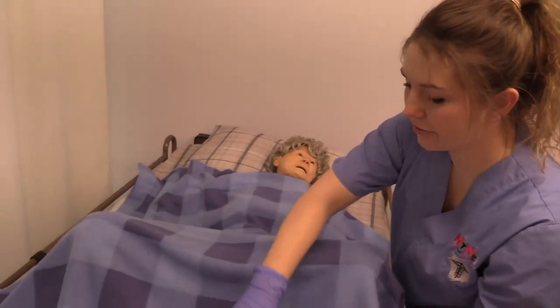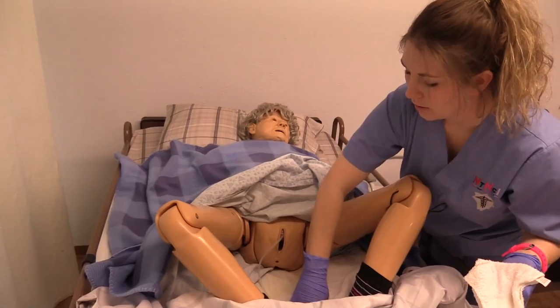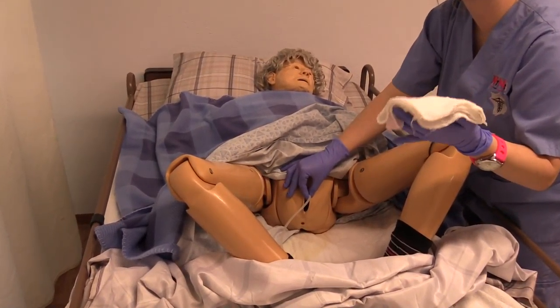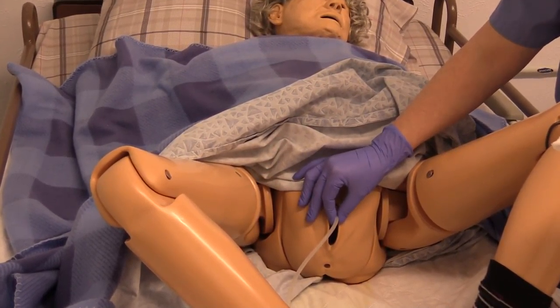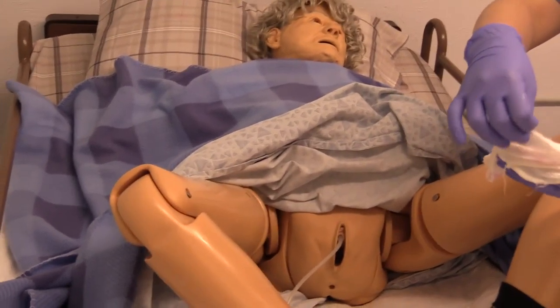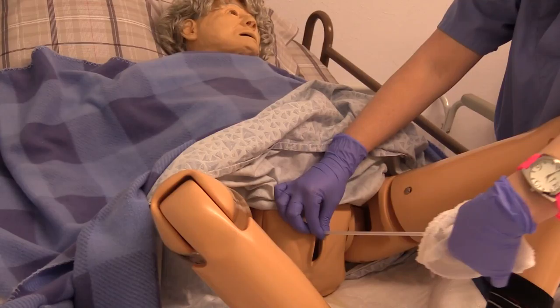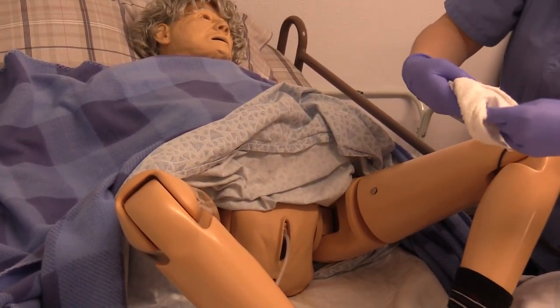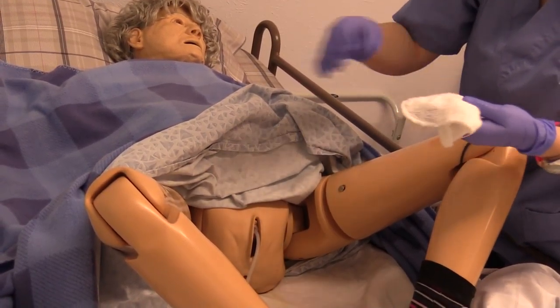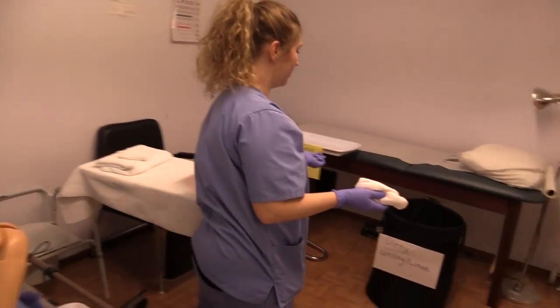Miss Jane, now we're going to do the catheter care. We will lift up the privacy blanket and her gown — here's the catheter. You are going to open the lips, hold the catheter at the meatus, and clean at least four inches of the catheter, making sure that you hold onto the catheter so you don't tug or pull it out. Using each folded section of the washcloth, clean at least four inches — holding at the meatus — for a total of three passes. Then place the washcloth in the dirty designated linen or utility area.